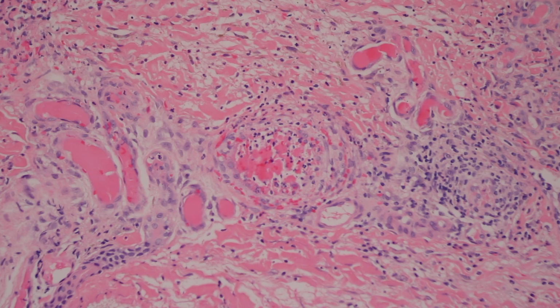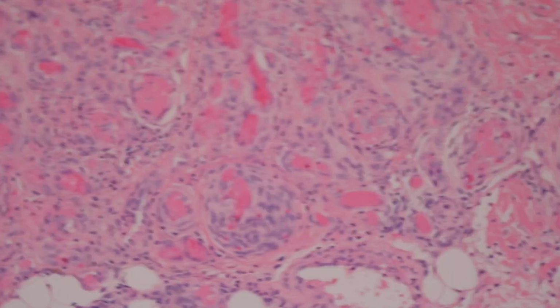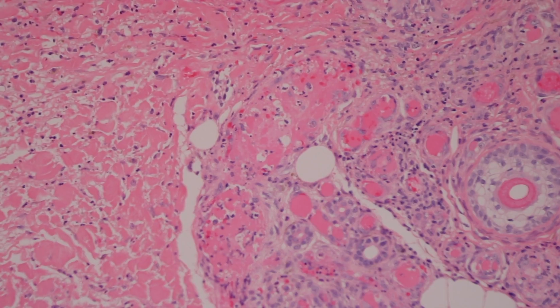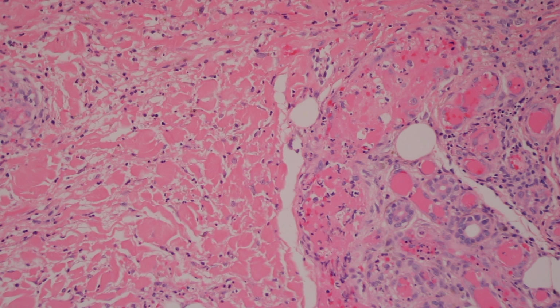But this material is actually cryoglobulins. This is cryoglobulinemia, what we call mixed type cryoglobulinemia. So there are three main types of cryoglobulinemia, and these are caused by different immunoglobulins that are making deposits in the vessels. So type 1 cryoglobulinemia just has cryoglobulin deposit in vessels with no vasculitis.